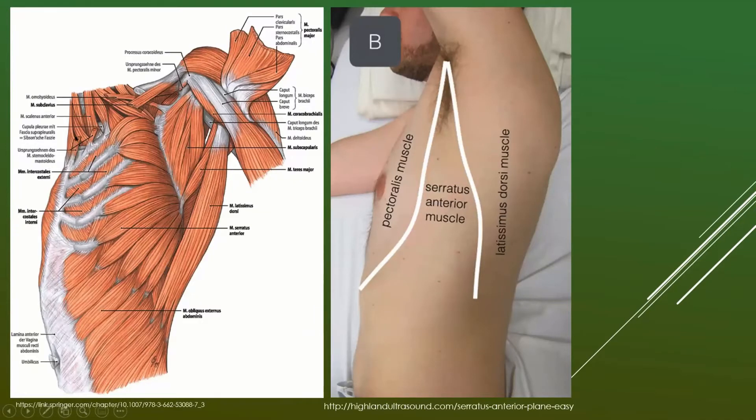The target area is along the lateral chest wall. You have the latissimus dorsi muscle coming across, and this is essentially the fascial plane in between the serratus and latissimus dorsi — that's where we're going to be depositing the anesthetic. When the patient breathes, that anesthetic is going to spread across that fascial plane and provide analgesia to most of the ribs. A common theme in nerve blocks is putting anesthetic into fascial planes or sheaths that nerves exist in, and the bathing of that area provides the analgesia.